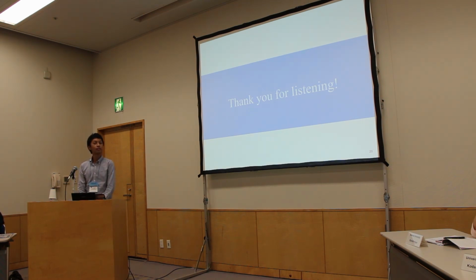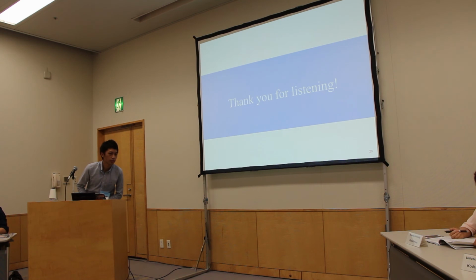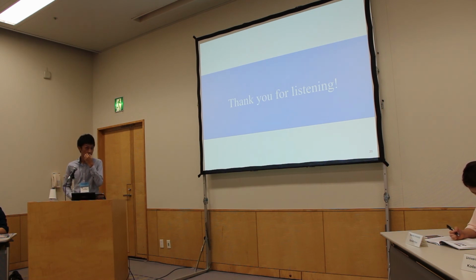Okay, my name is Muhammad Asaduddin. I'm from KAIST. I've also worked with EEG before, and I was wondering, when you do the bandpass filtering, you are looking for a response from your stimulus, so there is a possibility that the bandpass filtering actually filters out the response that you are looking for. So that's the first comment. That might be the reason why you have lower accuracy than you are expecting.